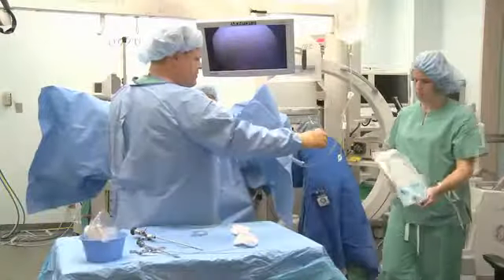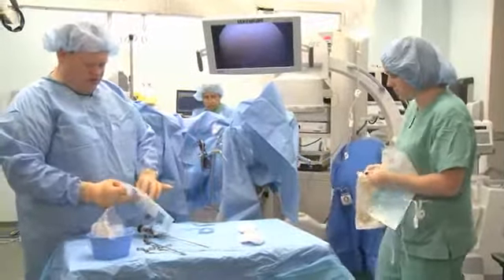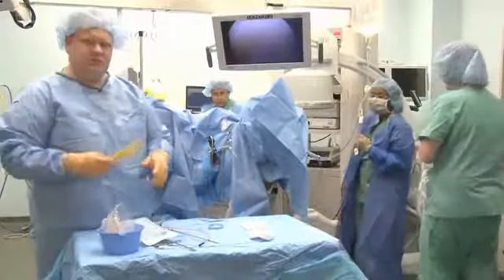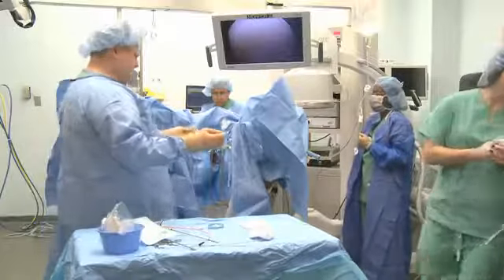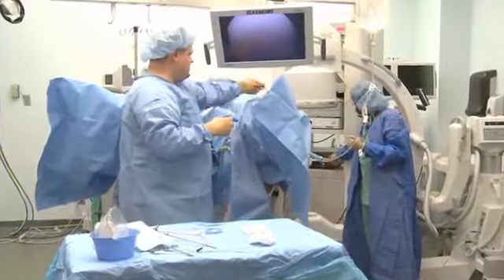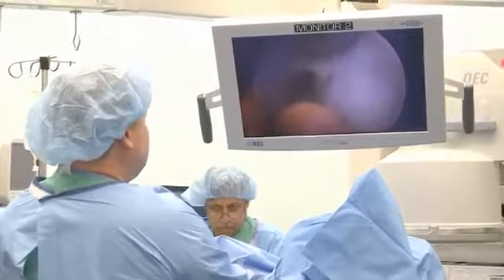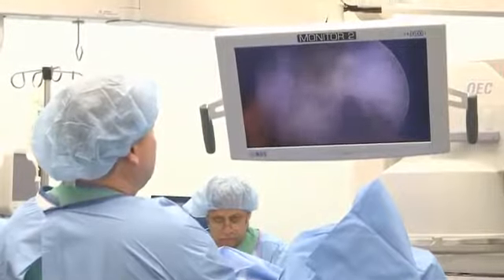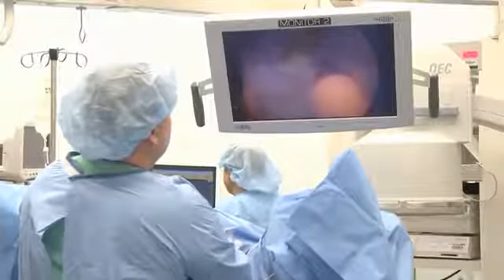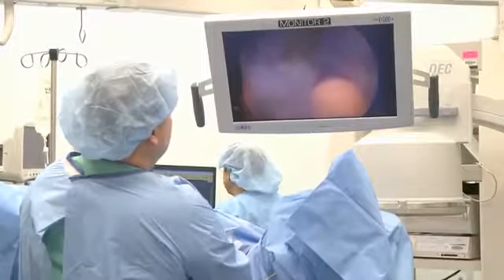We use this table for percutaneous nephrolithotomies also. And the two we've done, one has been from each side of the table, so it comes in handy that we can switch the C-arm so we can work on the opposite side. So this looks like it may have been a source of his bleeding. Just going to cauterize it a little bit. All right. One little tiny blood vessel bleeding there, we'll get that.